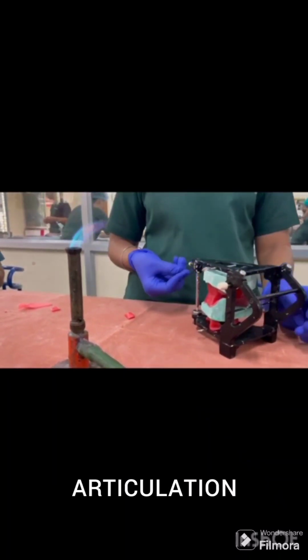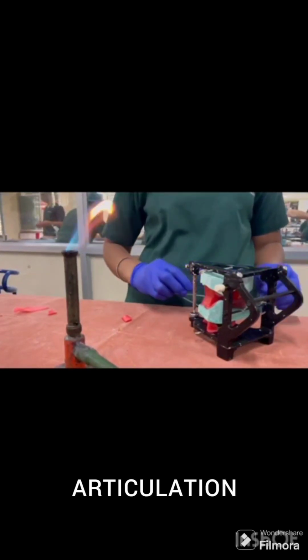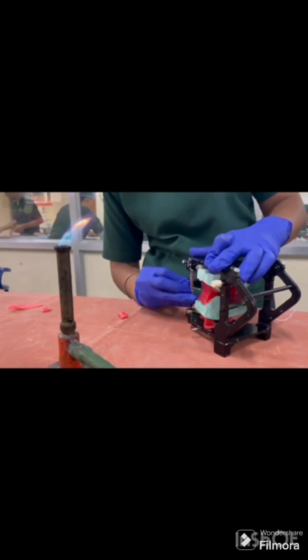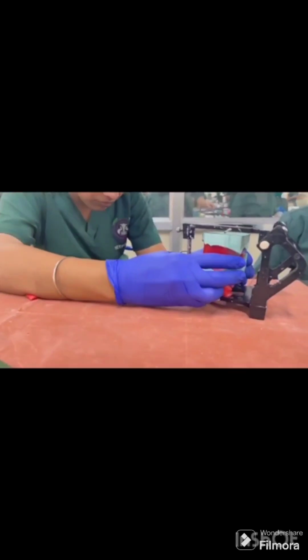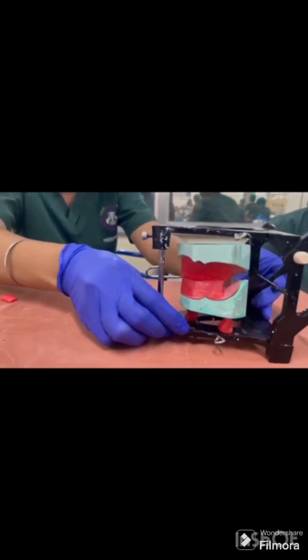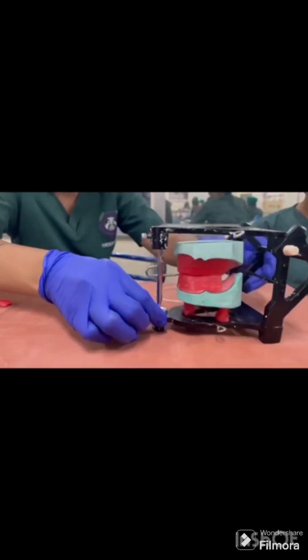Next is articulation. Once the jaw relation is obtained or tracings are done, the casts are articulated using the records. The most commonly used articulators are the mean value articulator and the semi-adjustable articulator. Procedure: the occlusal rims fused with the centric record are placed over the respective casts. A thread is suspended around the articulator.